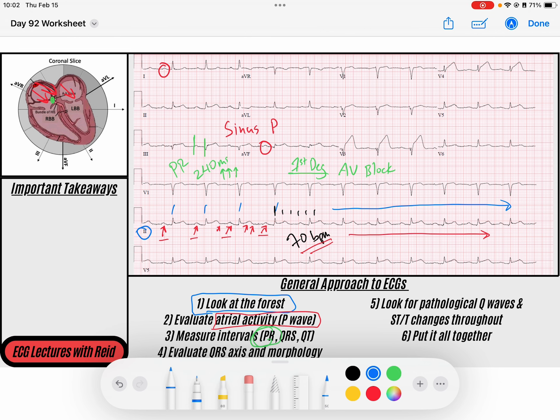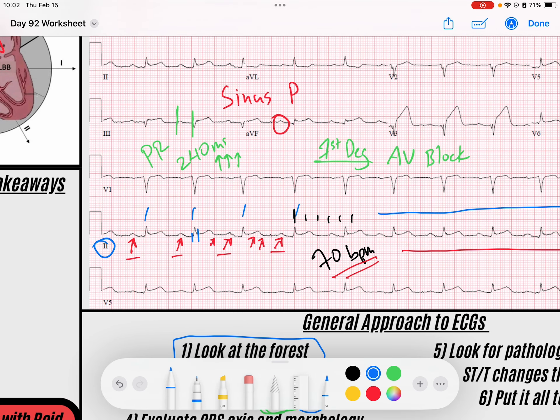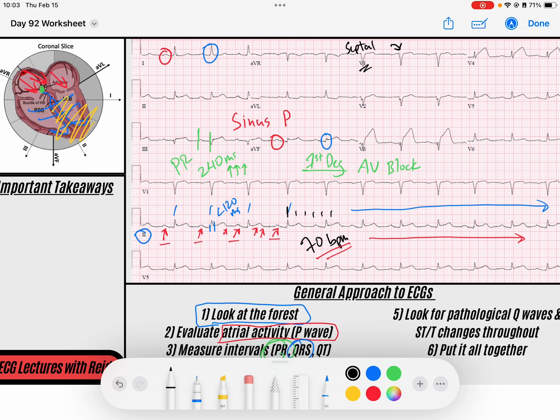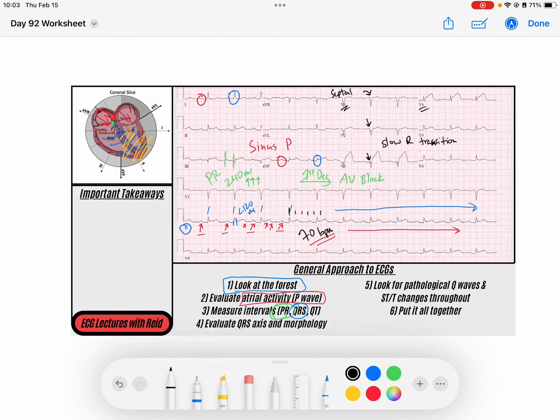Next, we evaluate the QRS complex. First, it's narrow — less than 120 milliseconds — which tells me the impulse is coming through the AV node down the His-Purkinje fibers, producing rapid ventricular depolarization. I have an upright QRS in lead 1 and an upright QRS in AVF, so my QRS axis is down and to the left, which is where it should be. I do see R waves in V1, so my septal R wave is present, but there appears to be slow transition of that R wave, not becoming dominant until around V4 — suggesting some poor R wave progression, the causes of which we'll come back to.